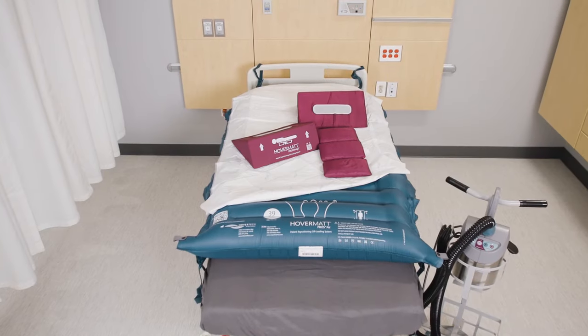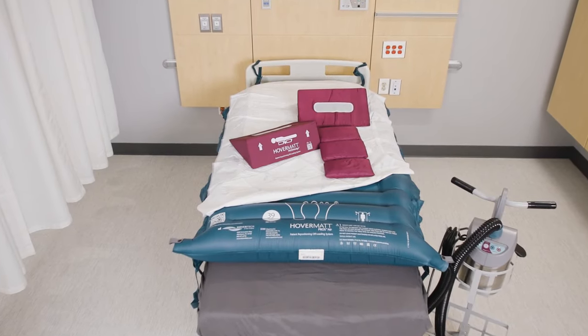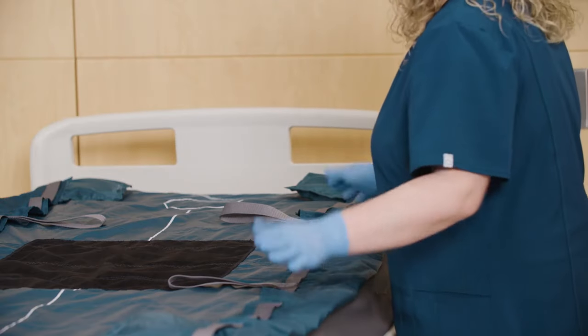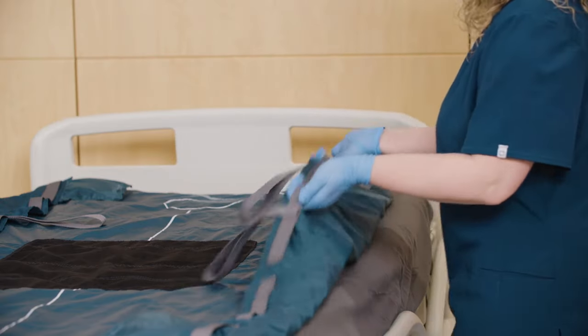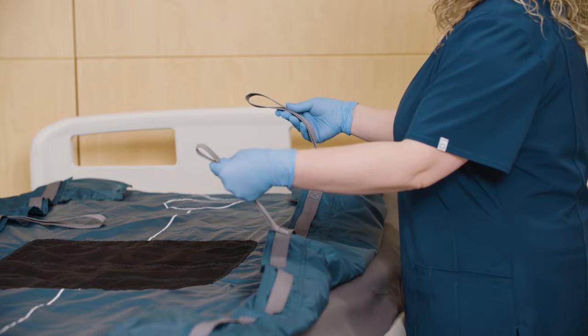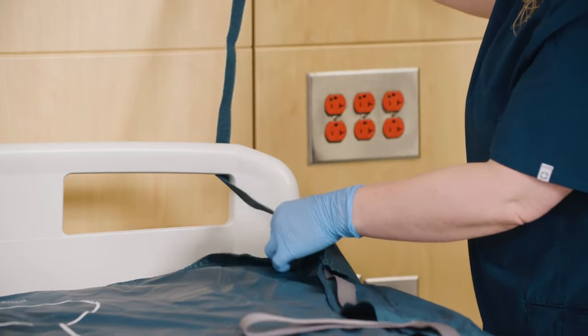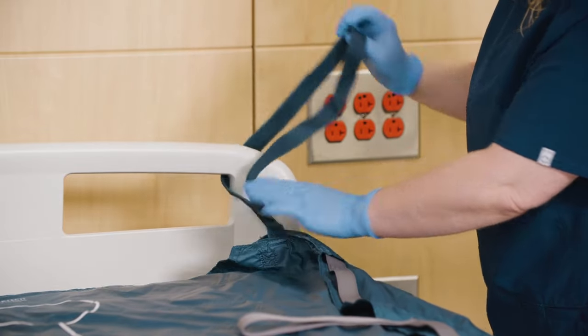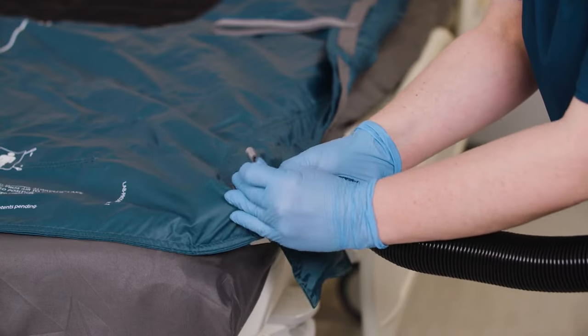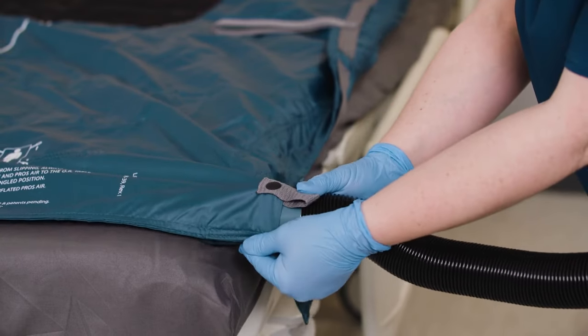The HoverMap Pro's AIR is a full-length, air-assisted mat that has a wipeable surface. There are handles down the length of the mat for ease of use and two turning straps on each side that can also be utilized with a lift for turning. There are four link straps located on each corner to reduce mat migration. The two air intake valves are located at the foot end of the mat, one on each side for easy access.